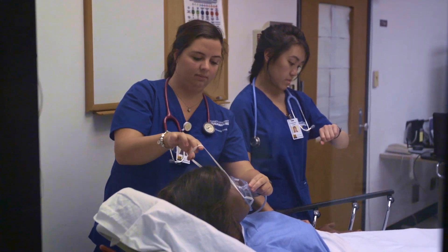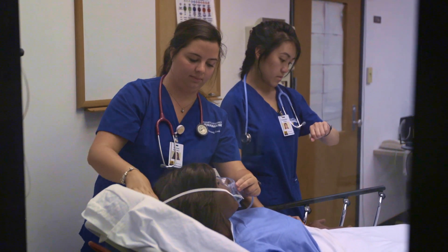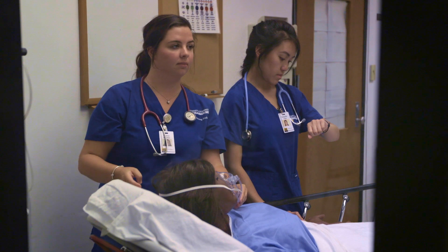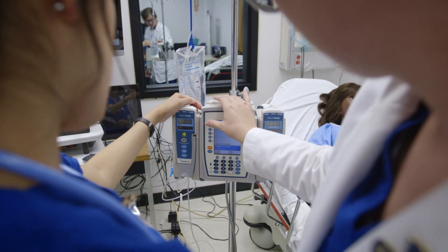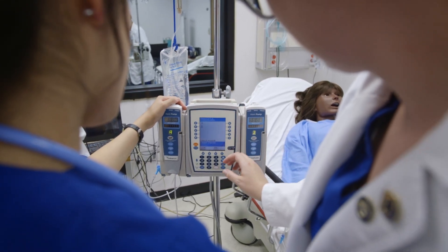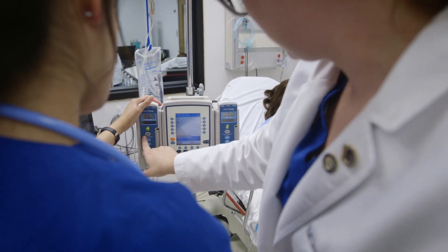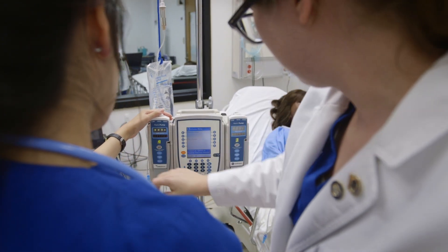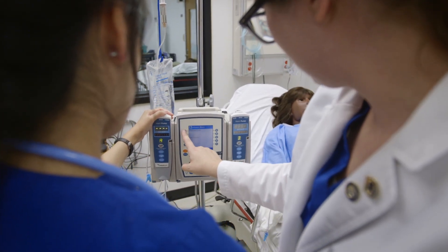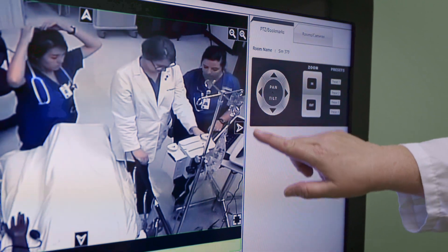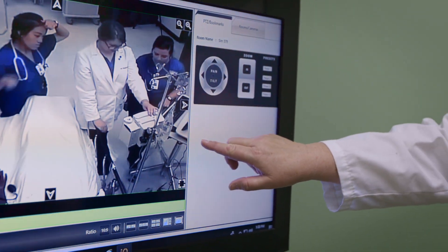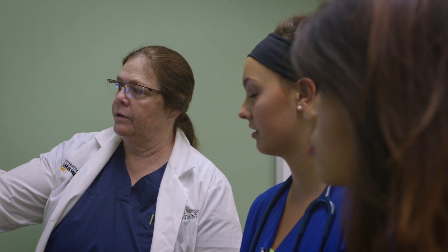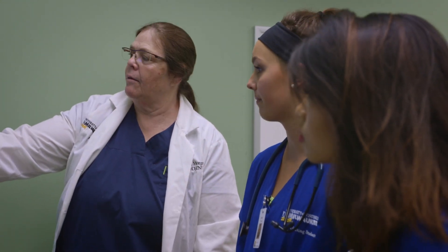Students usually practice in pairs while a nursing instructor sits in the control room behind the glass. The instructor manipulates the vital signs displayed on the monitor and speaks as the patient. While the student participates, cameras record the simulation and classmates and another instructor watch live. This allows students to review the simulation with the instructor after the scenario finishes, known as debriefing, which is vital to the student's learning process.